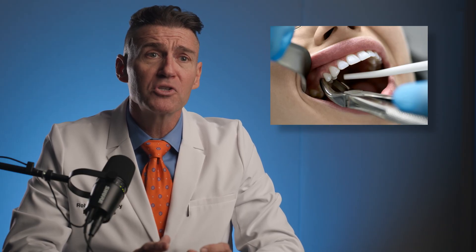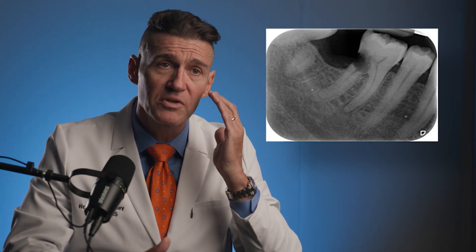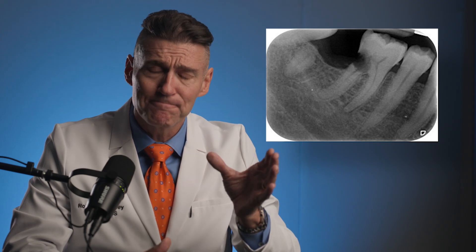Joking aside, it can be very, very stressful during extractions when the tooth separates from the root and the root tip is close to the vital structures. Because all root tips are close to vital structures — they're either sitting on top of the nerve or they're sitting below the floor of the sinus. So the goal in all of your extraction or avulsion cases is to prevent that from happening.